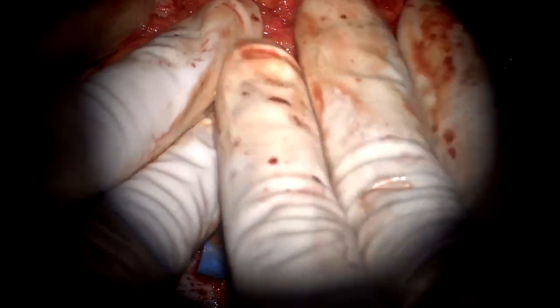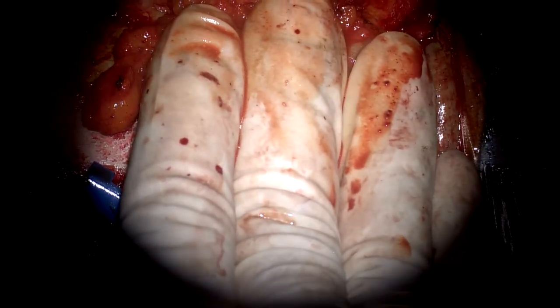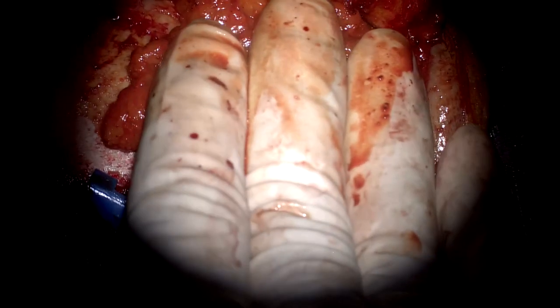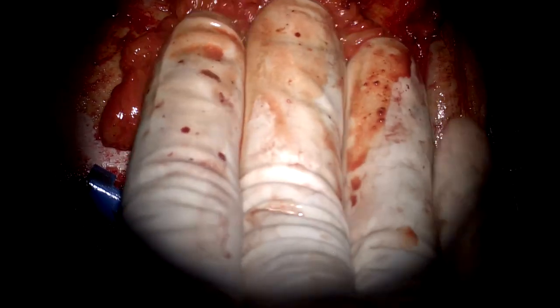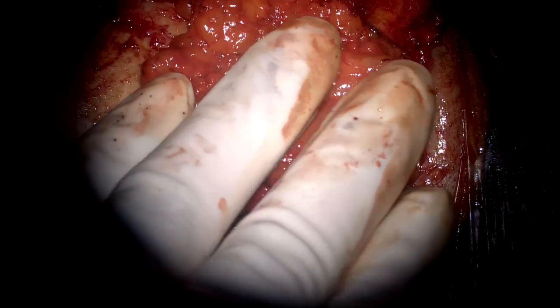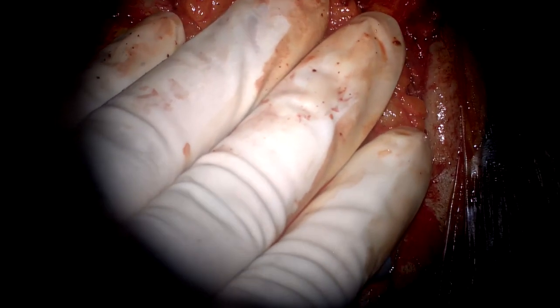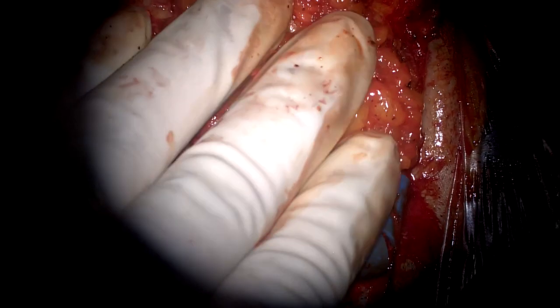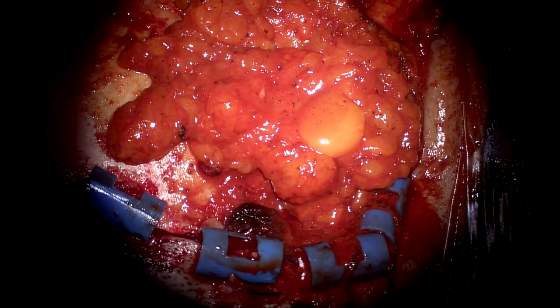See this? Ramesh, please close. Hello? Yes, sir. This will take care of it. This single piece will press on everything. Okay? Yes, sir. The three-dimensional tunnel is blocked by the fat. If for a single place you put fat like a stopper, like in a cochleostomy, cochleostomy is a two-dimensional closure. And this is a complete tunnel. It's a three-dimensional closure, so it doesn't leak. Don't worry. Make it tight. Thank you.